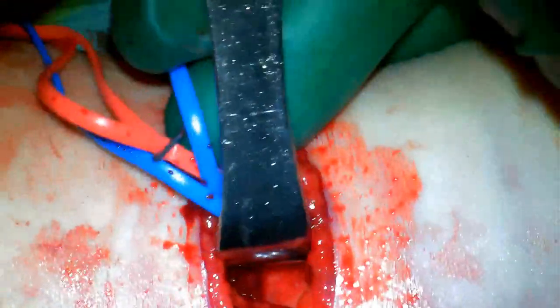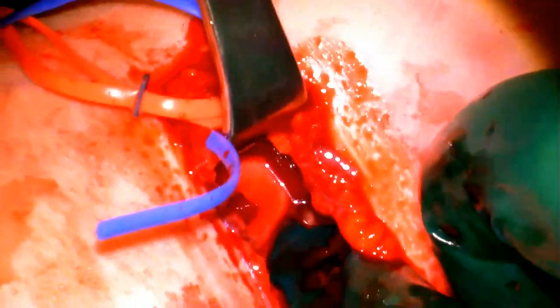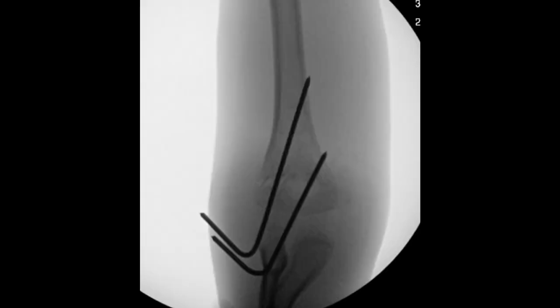We'll put the Army-Navy under them, lift up so we can see all the way over the front of the humerus. The surgeon's finger is put on that fragment, pushing it posteriorly, and the elbow is brought up into flexion for pinning in the usual manner. In flexion, the fluoro demonstrates an acceptable reduction with the anterior humeral line going through the capitellum. On the AP, the columns are lined up, and Baumann's angle is about 73 degrees.